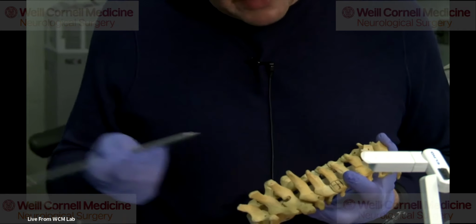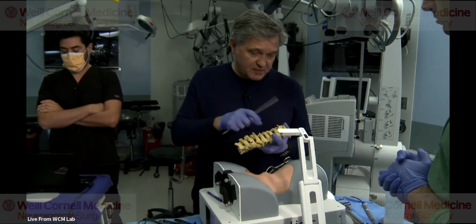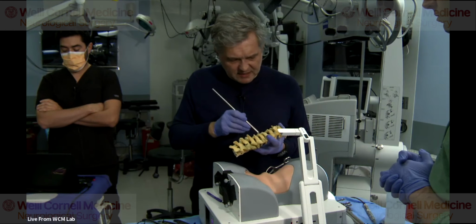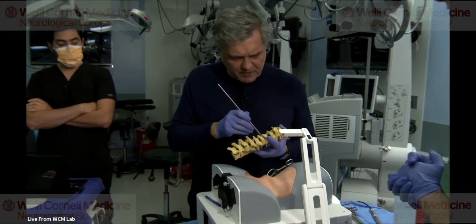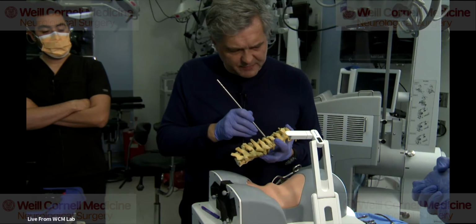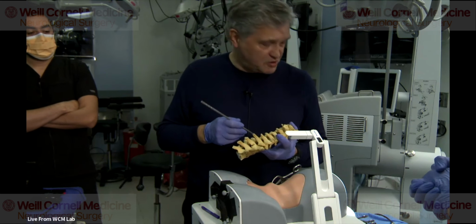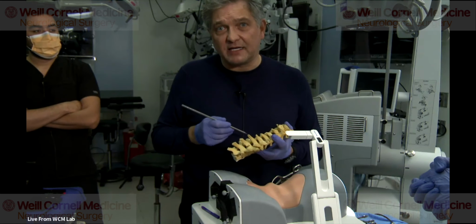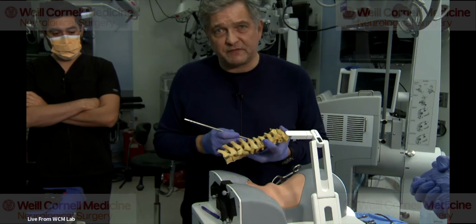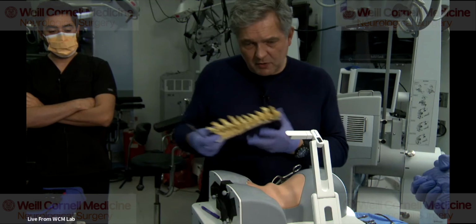So that's another reason, obviously, why I don't push like in the lumbar spine, but I really dissect down with Metzenbaum scissors and with clamps until I see the bone, and then I confirm that with navigation. And when I'm at this spot here, then I'll typically put in the first dilator under direct visualization under the microscope, and then I start dilating. And once you have the first dilator in, the second dilator, you're safe. You're not going to plunge through anything. So that's how I would do it.